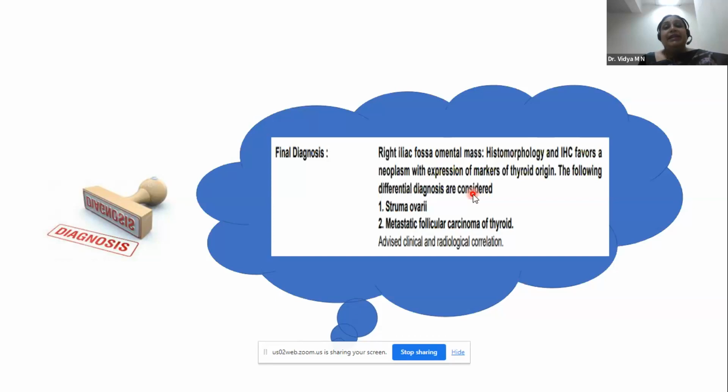So many times you will need to get back to your histomorphology. IHC alone will not help you, and IHC may be confusing many times because there are going to be overlapping phenotypes. As I said, for example, GATA3. GATA3 is going to stain your breast as well as your urothelial. So you need to be very, very strong on your histomorphology before you start ordering the panels.